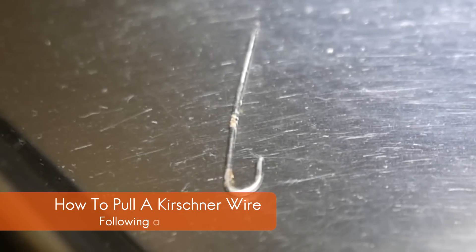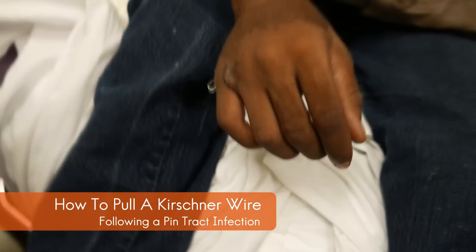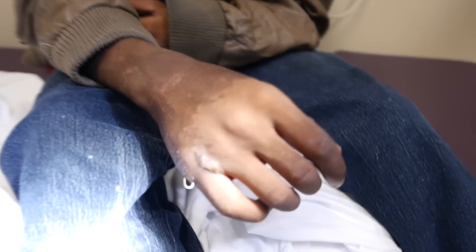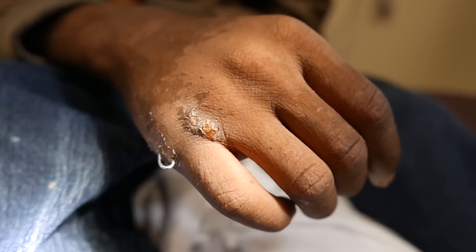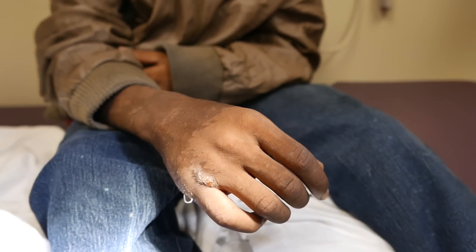We've got one pin that fell out and another one here with a pin track infection. These pins were probably put in about a month ago. Basically, the patient has been having pus draining out of both pins. While here in the ER, one of the pins was being expelled and actually came out.